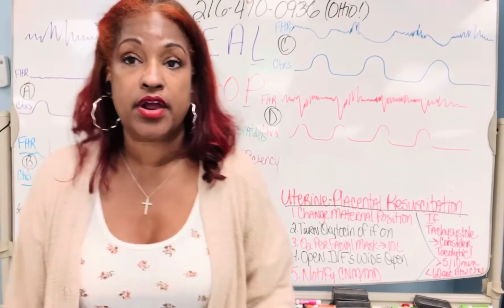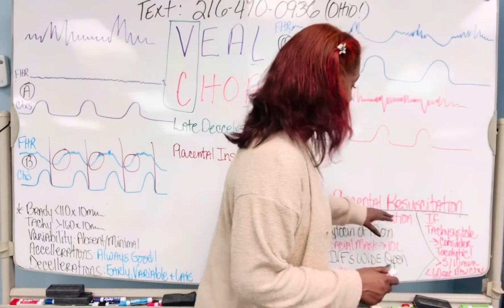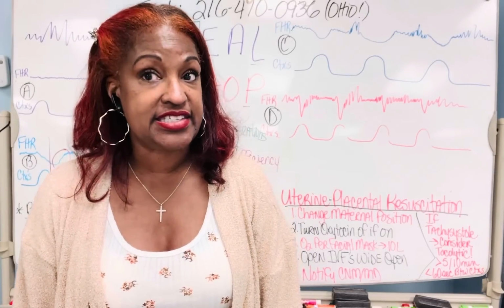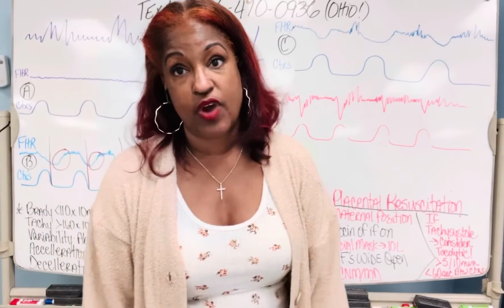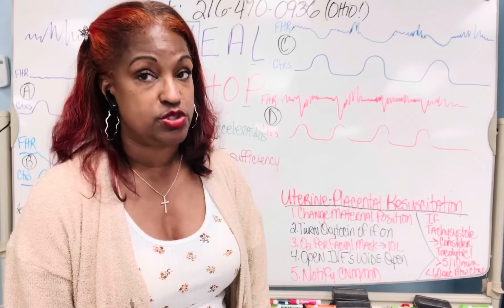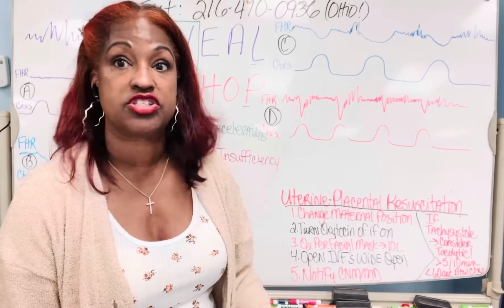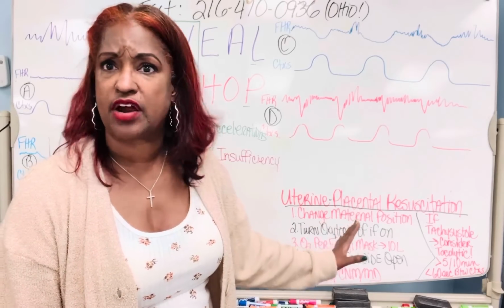Now, in the rare instance that you have all this going on and it turns out that the patient also has tachysystole contractions, which is inadequate relaxation between contractions, meaning less than 60 seconds rest between them, or what did we say earlier? More than 5 contractions in 10 minutes. If your patient's doing all that, they may even need a little shot of terbutaline, which is a tocolytic, to slow these contractions down or just stop them. Give this baby time to recover. We're gonna be in trouble. Late decels are the worst.